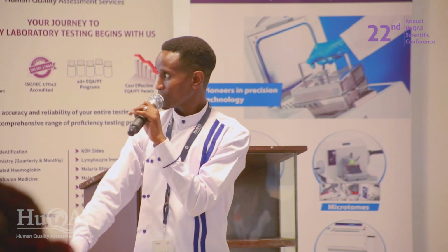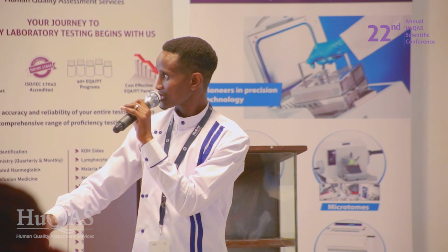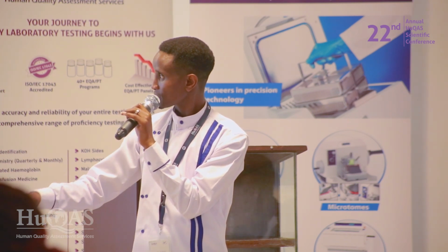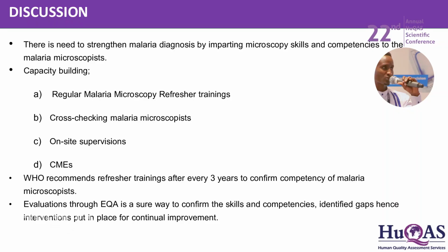So what is our conclusion for this? Of course, I think I discussed that. No, this is supposed to be the conclusion, sorry. There is a need to strengthen malaria diagnosis by imparting malaria microscopy skills and competencies to our malaria microscopists. Not only those who are participating in this program, but I think this is a representation of what could be happening on the ground. So what can we do? We need to strengthen the skills to ensure the microscopists are able to pick the malaria parasites, species them where necessary, and do quantification when necessary.